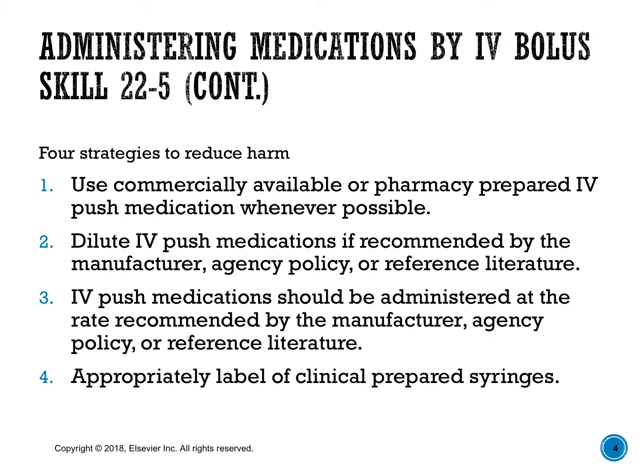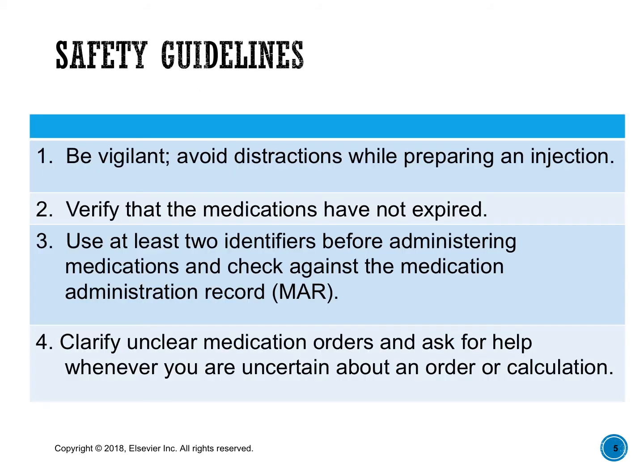Because otherwise, when we get to the bedside and we're supposed to do that third check, how can we do that third check if we don't know what we have in our syringe? So it's going to be really important to label. We're the final check to keep our patients safe.